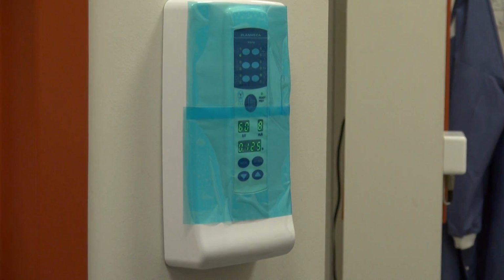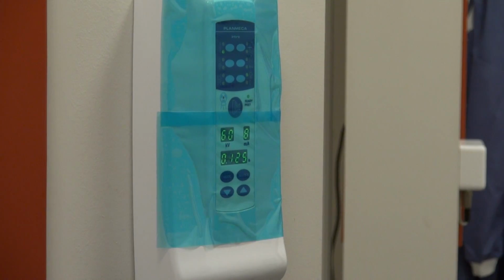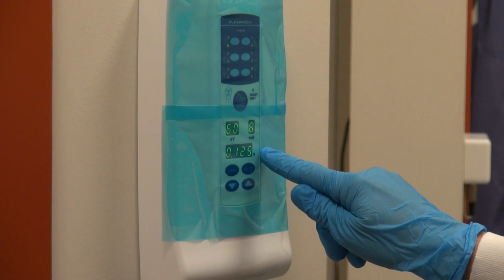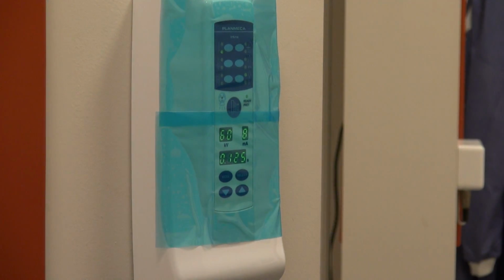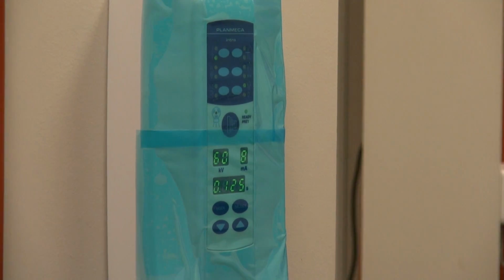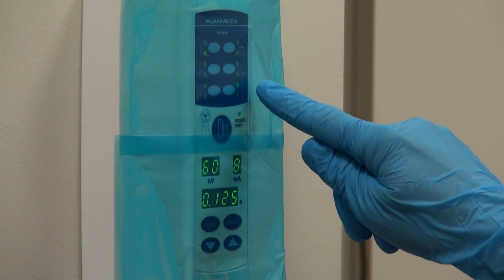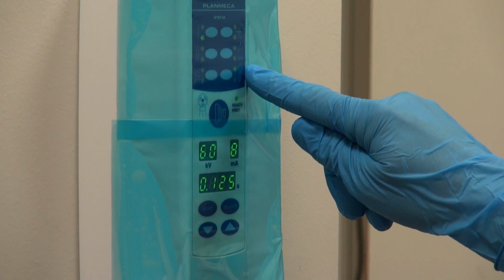We will be using film as our image receptor, so the control panel should be set to the film setting, which will show the exposure time only. Dexter is considered an adult for today's lesson, so the adult icon will be lit.